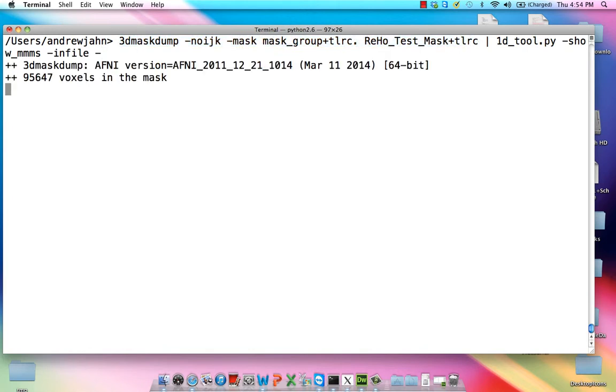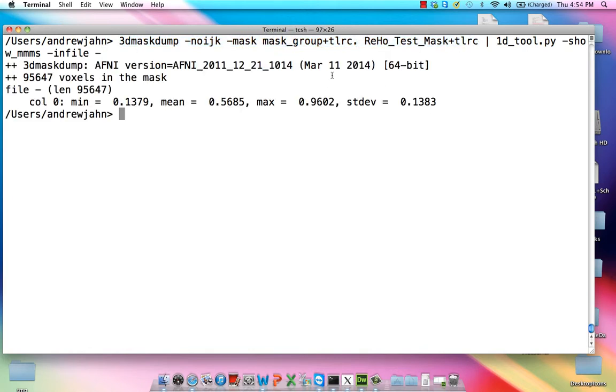We hit enter, and we get a bunch of different values. We're going to focus on the mean and also the standard deviation. Notice the mean is 0.57 roughly, standard deviation is 0.14 across all of the voxels for this whole brain mask.